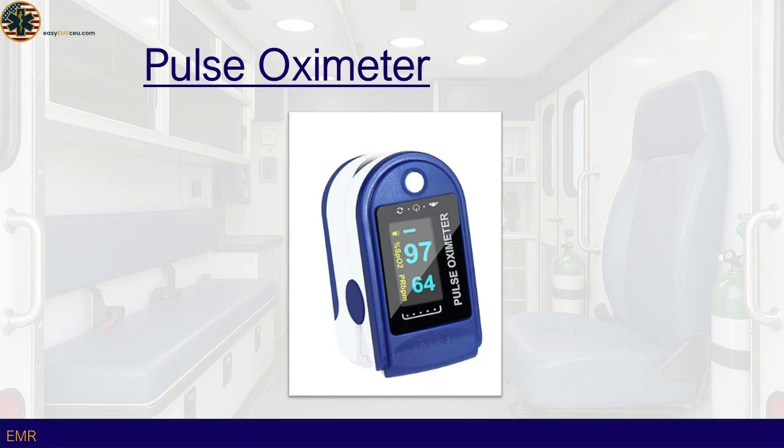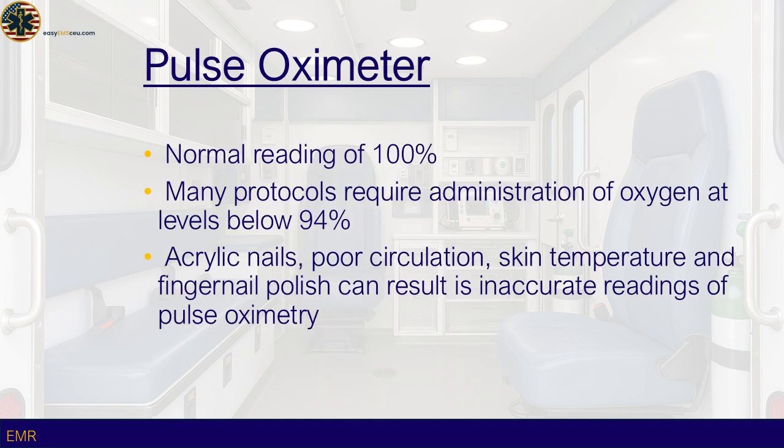In cases of respiratory distress, trauma, or cardiac arrest, a pulse oximeter helps determine the effectiveness of ventilation and circulation. However, while pulse oximeters are valuable, EMS providers must understand their limitations. Readings can be affected by poor perfusion, nail polish, ambient light, and conditions such as carbon monoxide poisoning, where carboxyhemoglobin can falsely elevate SpO2 levels. Therefore, pulse oximetry should always be used alongside clinical assessment and other monitoring tools like capnography. Despite these limitations, pulse oximeters remain a fast, reliable, and indispensable device in pre-hospital care, allowing EMS professionals to make timely, informed decisions in critical situations.